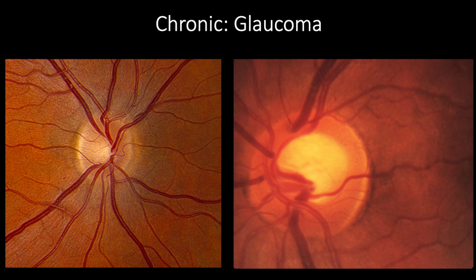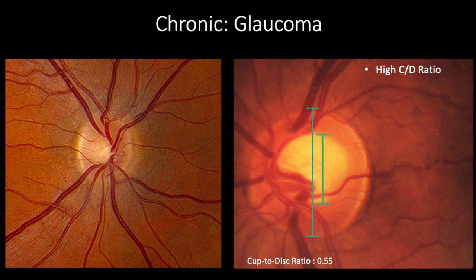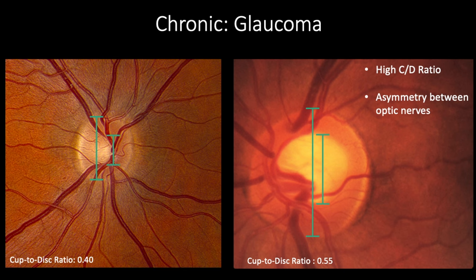The final condition we will review is glaucoma, the second leading cause of blindness worldwide. Glaucoma describes a group of progressive conditions characterized by cupping of the optic disc due to retinal ganglion cell loss. Key findings include a high cup-to-disc ratio — the optic disc on the right side of the screen is experiencing greater cupping compared to the one on the left. A difference of 0.2 or more between optic nerves raises suspicion of possible glaucoma.